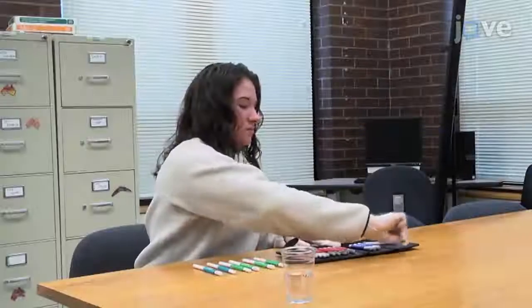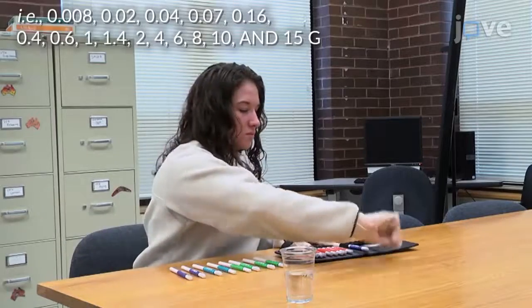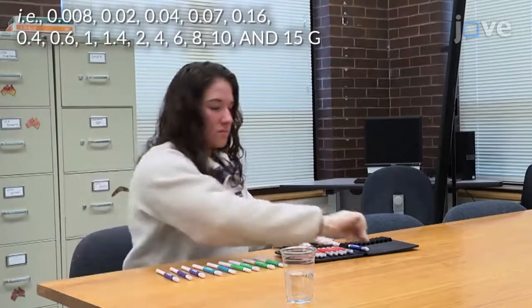To set up the experiment, place the monofilaments with the indicated target forces onto a table so that each target level can be easily read. Then seat the participant in a comfortable chair with a glass of water within arm's reach.